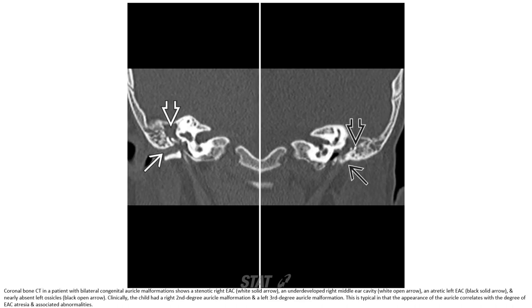Coronal CT image of bilateral combined auricular malformation: a stenotic right external ear canal and underdeveloped right middle ear cavity, and atretic left external ear canal with nearly absent ossicles. The child had second-degree auricular malformation on one side and third-degree auricular malformation on the other, typical in appearance with varying degrees of ear canal atresia and associated ossicular abnormality.